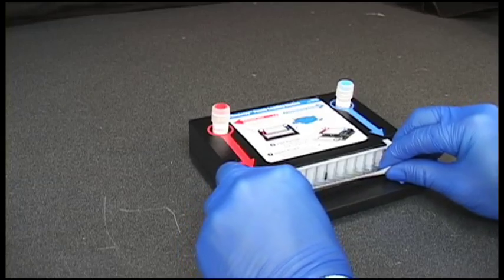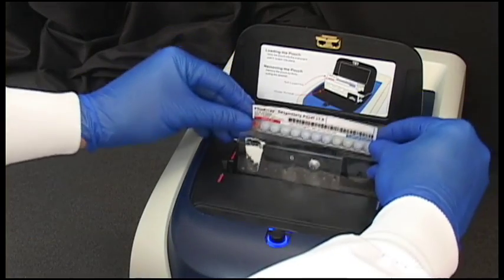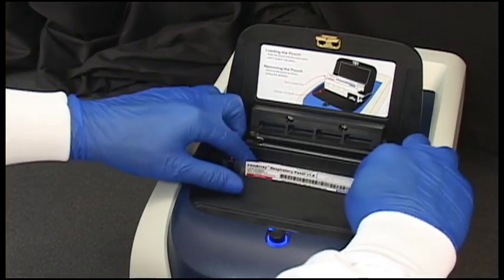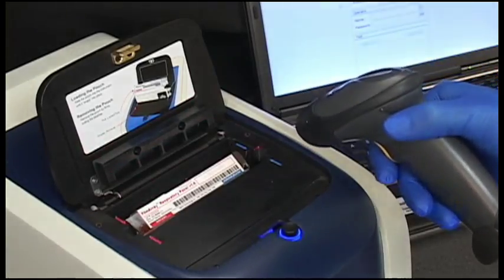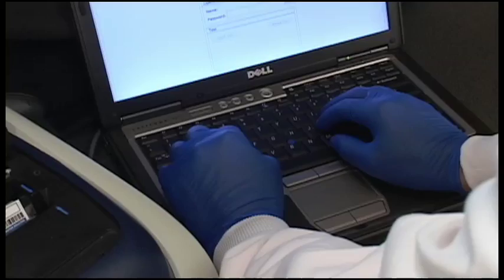The FilmArray instrument is now ready to set up. The FilmArray pouch is loaded into the FilmArray instrument and a barcode reader is used to enter the pouch ID. The sample ID can also be scanned with the barcode reader or entered manually.